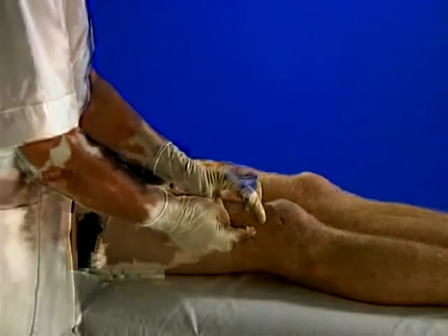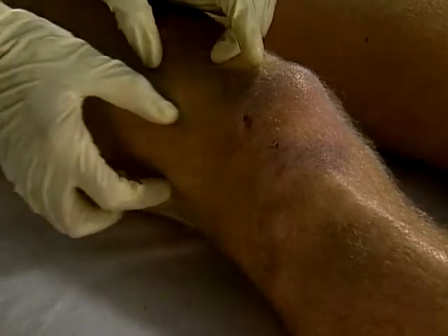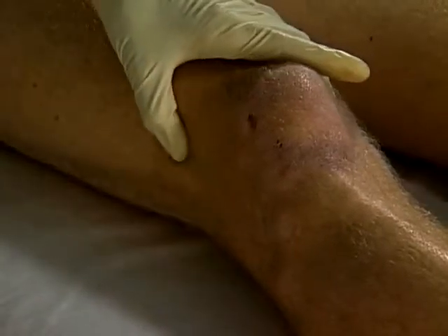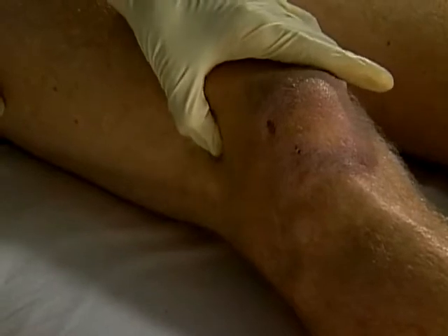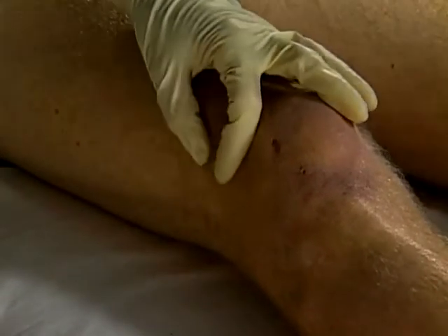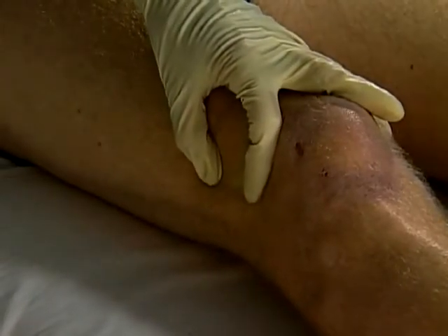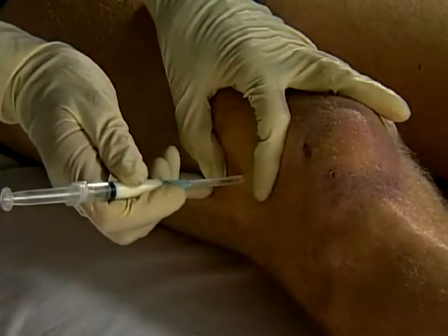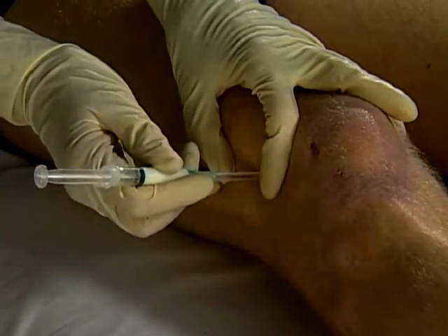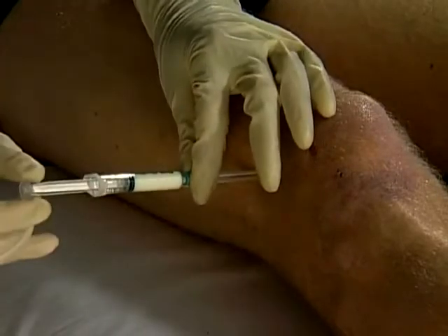The bursa lies immediately below the distal end of the band. Palpate for tenderness and mark the entry point at epicenter. Clean and firmly stretch skin and rapidly insert needle perpendicularly. Pass needle down to gently touch bone. Withdraw slightly, aspirate, and inject as a bolus.